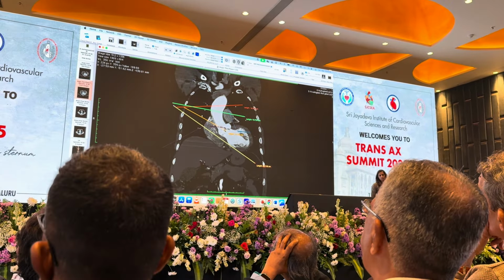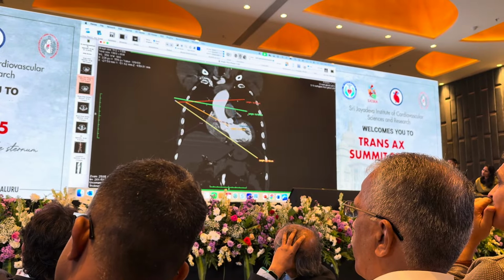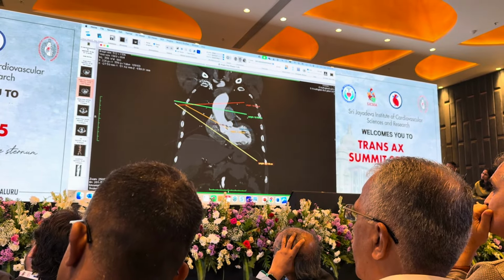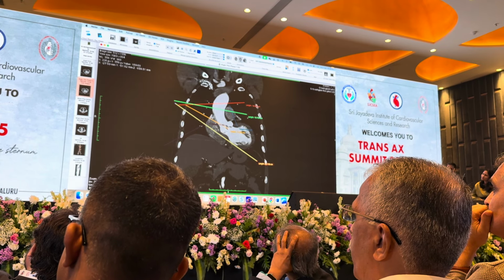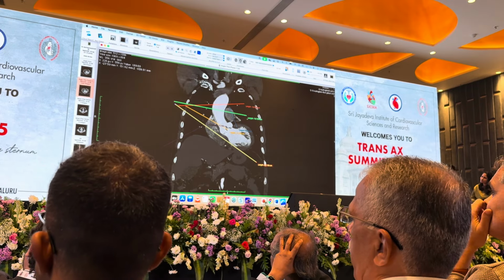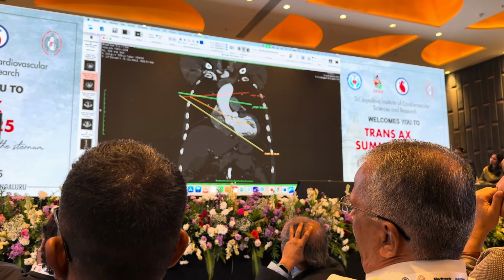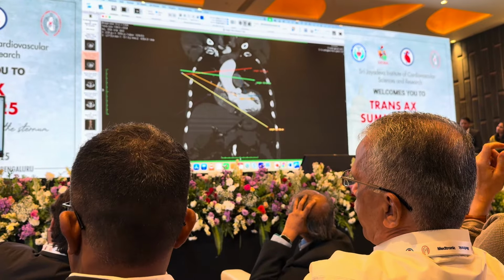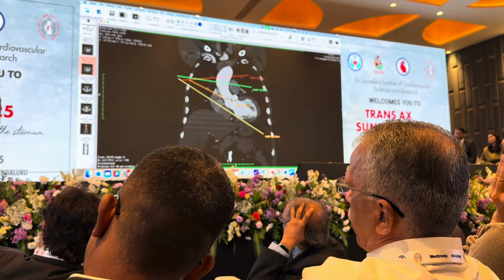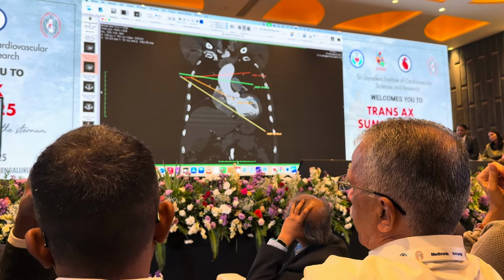One more thing important to consider is how you make your CT scan. Most patients on the CT scan are with arms like this, up. So that's why for the aortic valve, we kept this position. We want to remain consistent with the position the patient has on a CT scan. Because when you pull up the arms, the cage goes up, while the sternum remains there. Something that you have to keep in mind. So arm down, cage goes down. Your space will be lower. Keep it in mind.